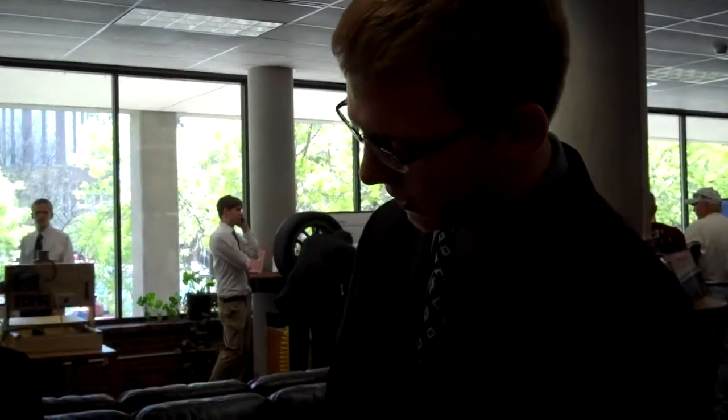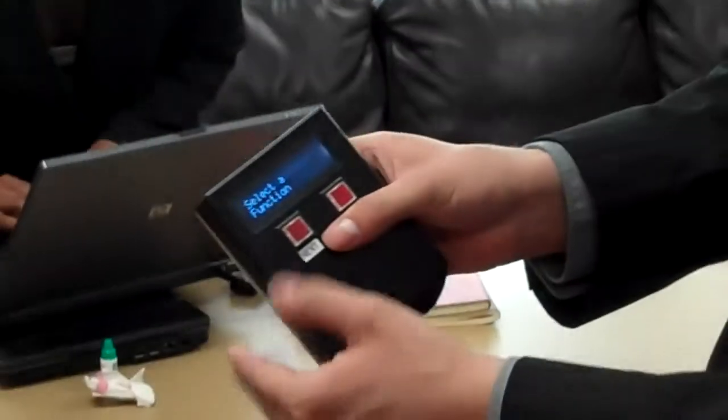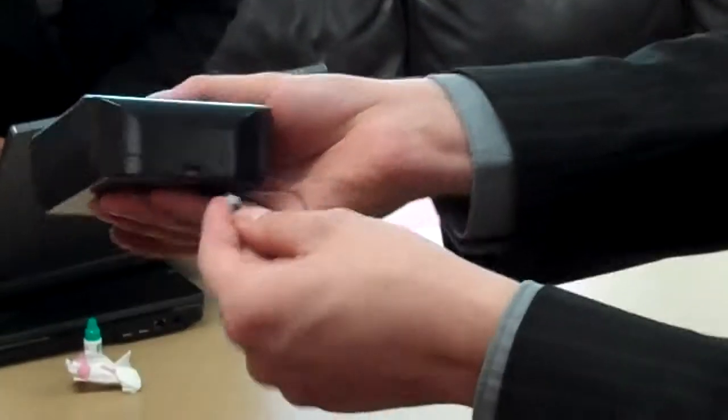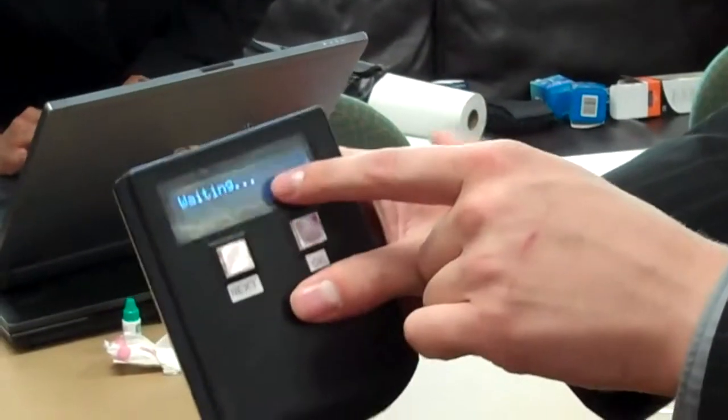So I'll start here. Turn it on. It says glucose reader and asks you to select a function. We'll go over to take readings, the first one. You can see it lights up down here. Strip in, hit OK, and now it's waiting for a sample.